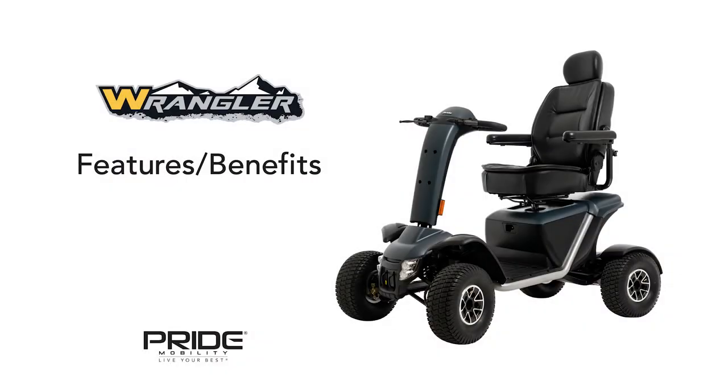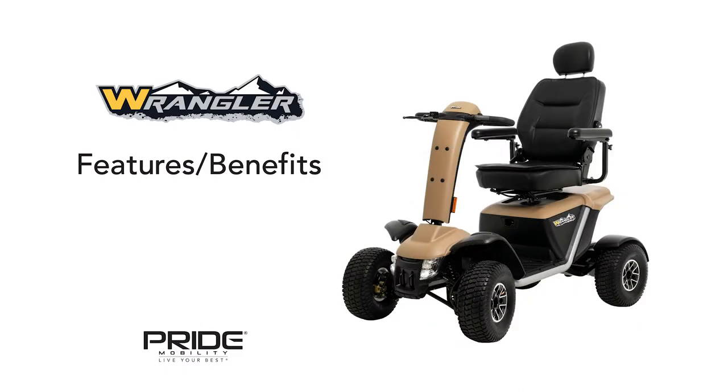Pride Mobility is proud to reintroduce the all-new Wrangler Scooter. Your outdoor adventure waits with a sleek new rugged design and built-to-last scooter. The Wrangler comes in two colors: stone gray and desert sand.